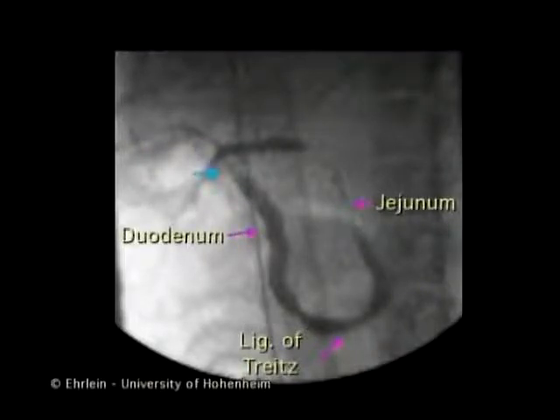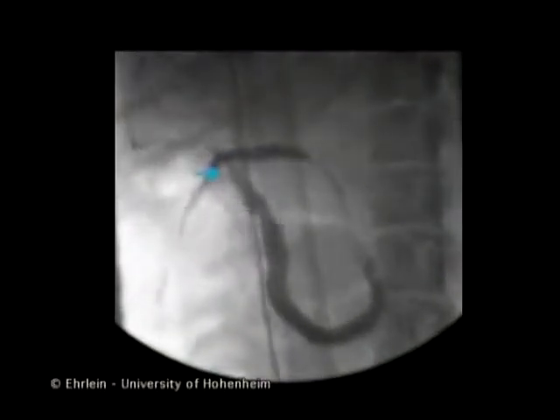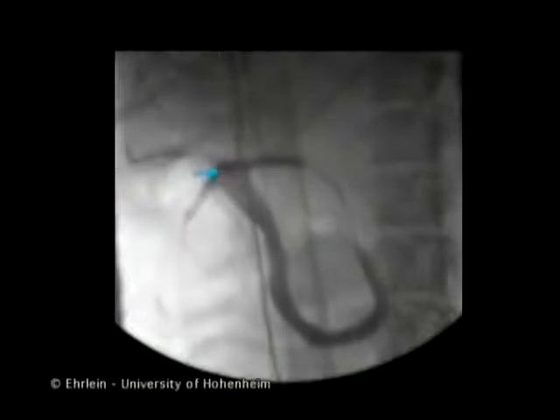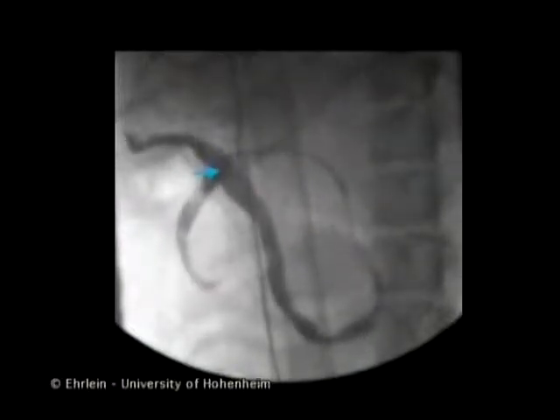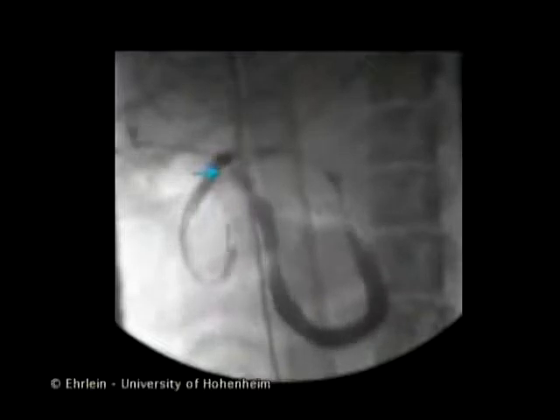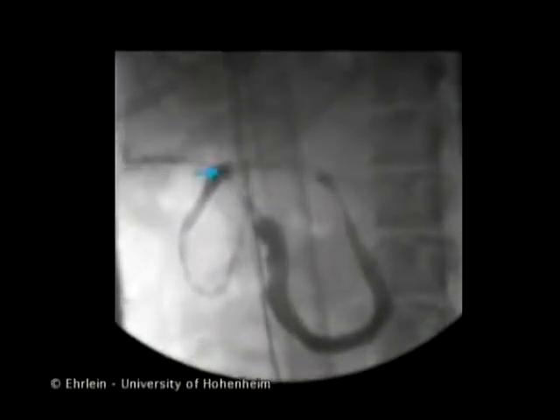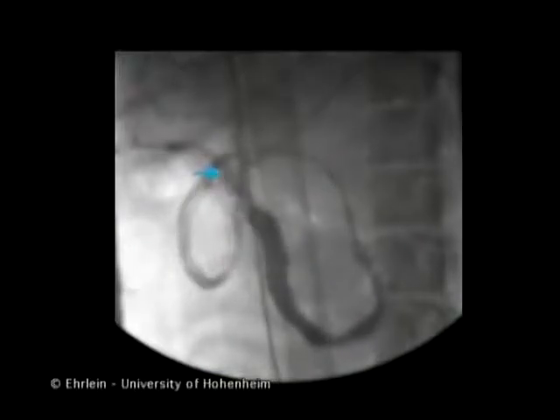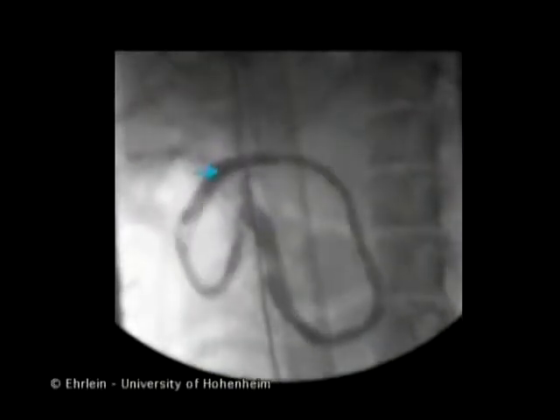The blue arrow marks the end of the duodenal peristaltic waves. The peristaltic waves originating at the duodenal bulb propagate to the end of the duodenum. Each subsequent wave terminates a few millimetres further distally. The length of the intestinal segment occupied by the phase three thereby increases.